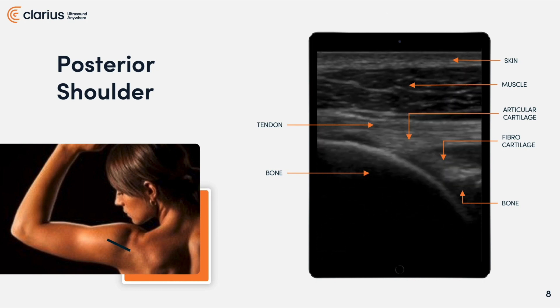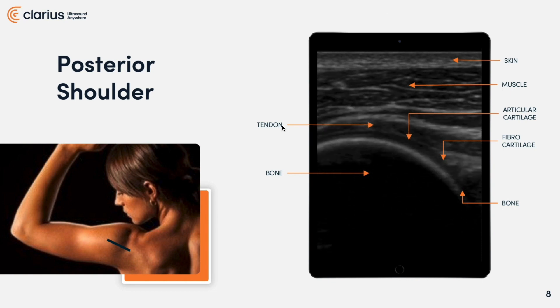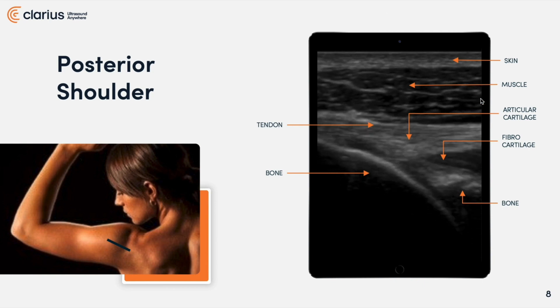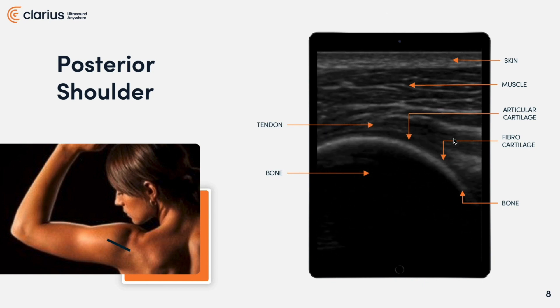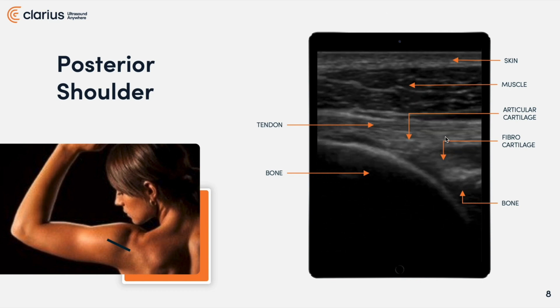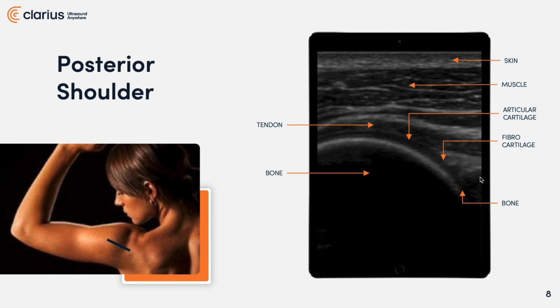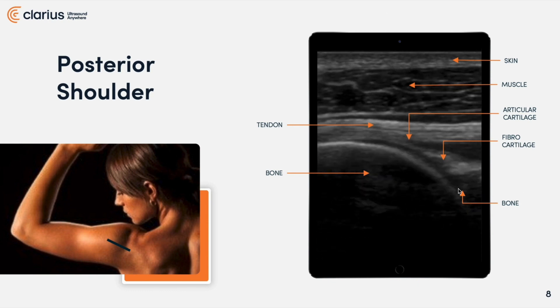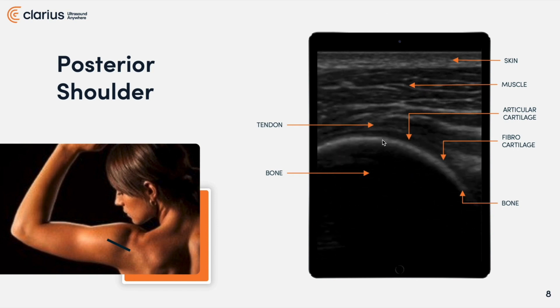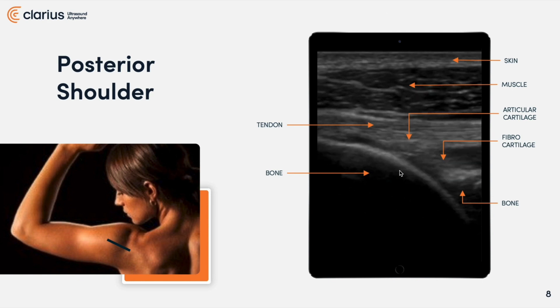Musculoskeletal ultrasound allows dynamic imaging. What you're witnessing here is the movement of this patient's arm into internal rotation, and this is external rotation. You're able to see the muscle changes in dimension of the deltoid simply because the infraspinatus is moving underneath it. You can see the tendon and insertion, and now the muscle fibers of the actual infraspinatus muscle. If you look close, you'll see that the labrum itself is altering its shape to correspond to the surface of the humeral head. And that dark region I'm pointing to right here — that's articular cartilage. We're actually able to see and dimension whether a patient has articular cartilage in varying views.